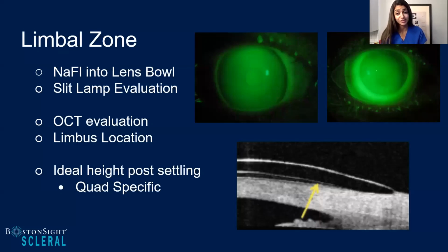So the question then becomes, Shalu, what's that ideal height? Yeah, it's a really good question. I think I aim for 40 to 60 microns. But again, I just want to make sure I'm not doing any harm. This image that you have here, Avani, where you see this dark band at the limbus, is tricky because this can be really deceiving, because you could look at that and say, hey, I've got touch at the limbus.